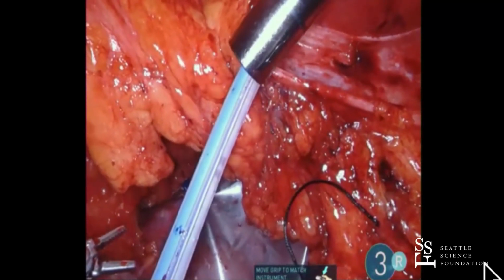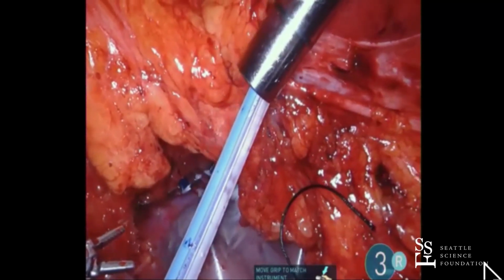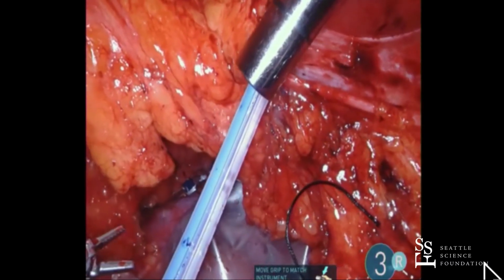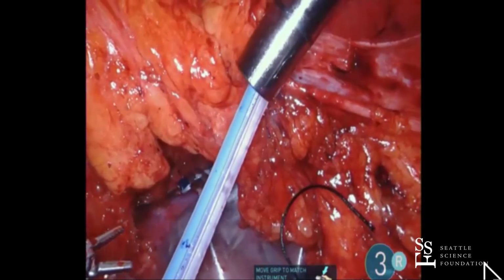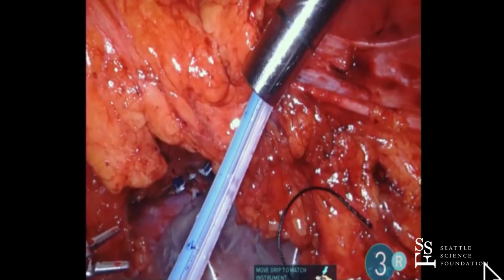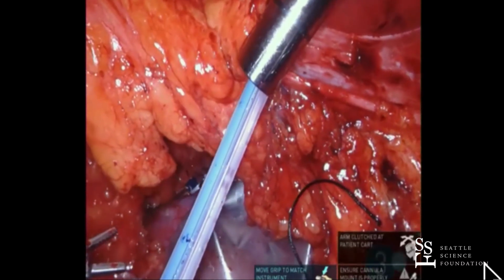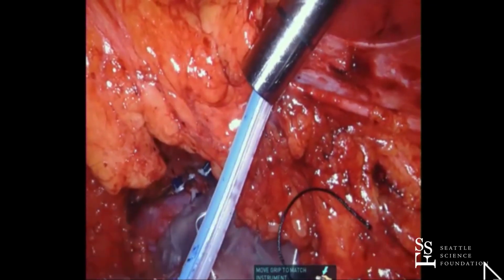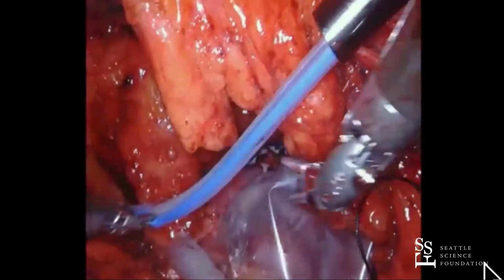The other reason we do it is for my learning and for my fellows' learning. We go from this procedure, and then we see how much we've taken, and we determine, did we take the right amount? Did we take too much? Did we take too little? It allows you to fine-tune your technique by looking at your margin, because you just don't really know until you look at it how much you've actually taken.